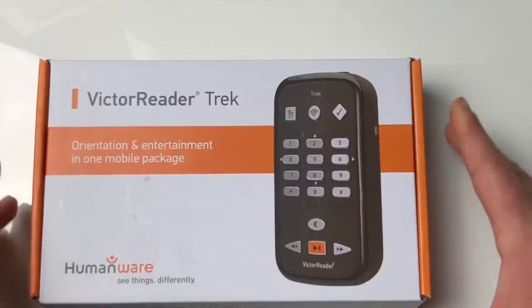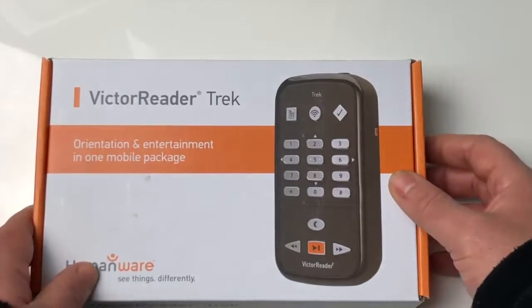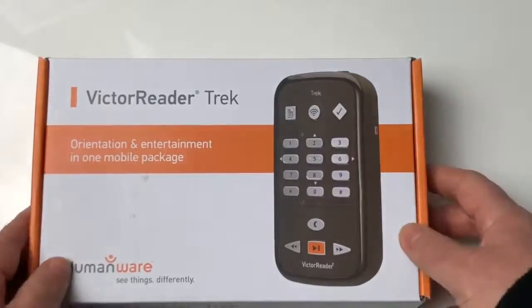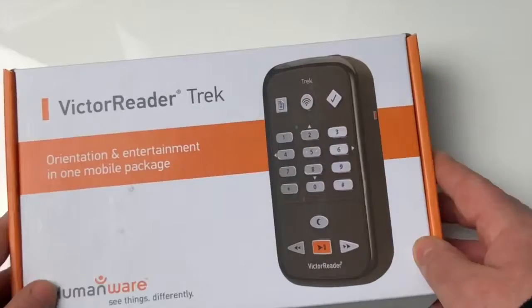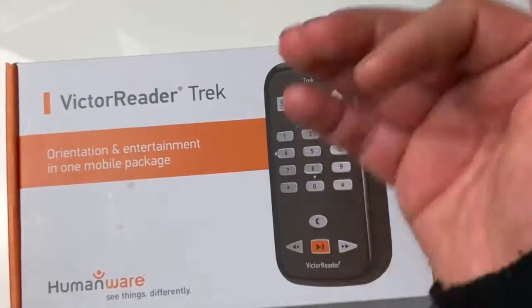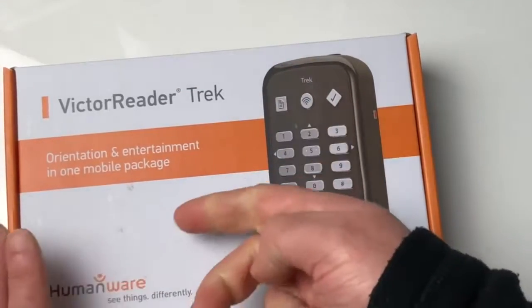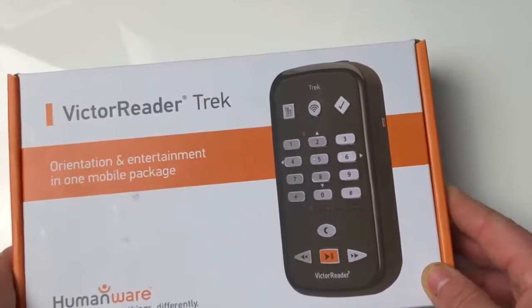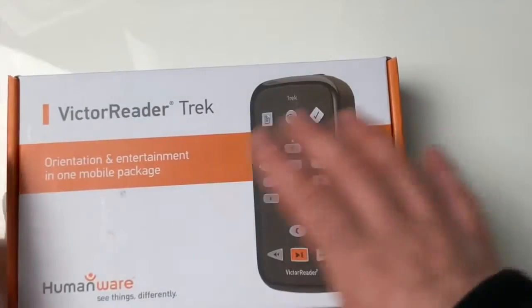Aujourd'hui on va faire par étapes : je préfère vous faire l'unboxing, le déballage de cette boîte. Pour les gens qui vont faire l'acquisition, ils pourront se référer à cette vidéo au fur et à mesure que les éléments sortent de la boîte. Il y aura plusieurs vidéos sur cet appareil — on fera ensemble le premier démarrage, comment créer des routes, etc. N'hésitez pas à vous abonner à la chaîne, à liker cette vidéo et à la partager. On rentre donc dans le déballage du nouveau Victor Reader Trek : nouveau GPS, lecteur de livres, radio.